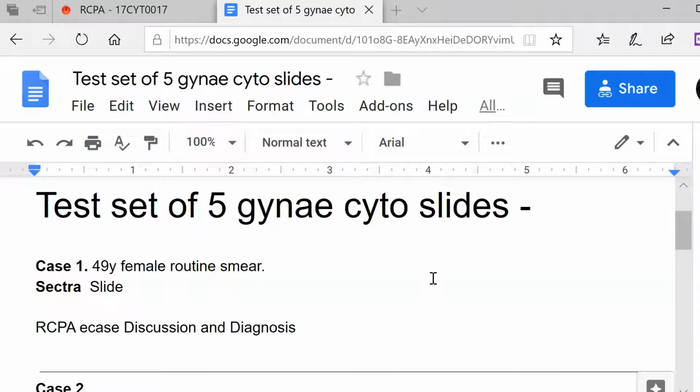In this video, I will show you how to make and share a digital slide workshop. Here I've constructed it in a Google document, but you could easily use a Word document, Excel spreadsheet, or type this directly into your email program.